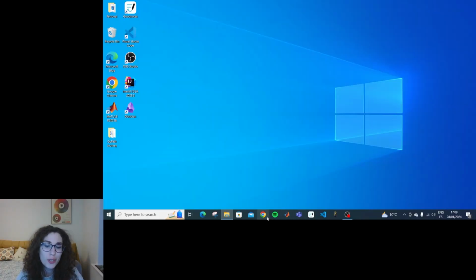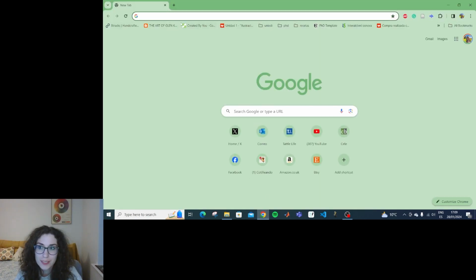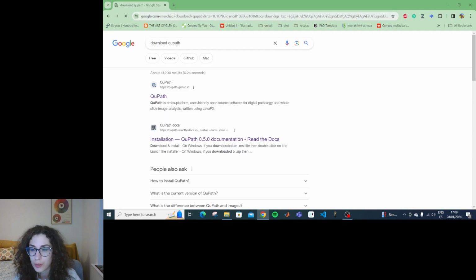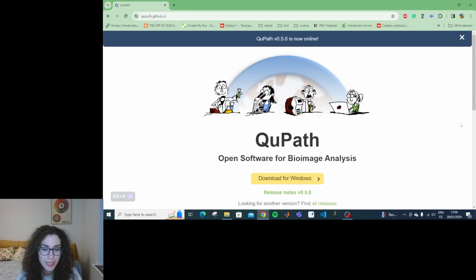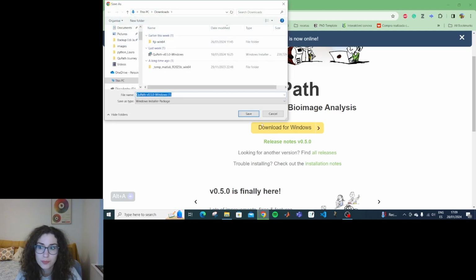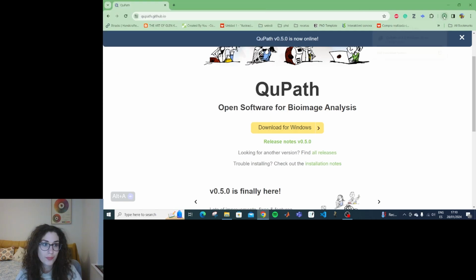Hi, let's install QuPath. For that, just use your favorite web browser, download QuPath, get this landing page, and you can just click here or use the arrow to select other installation options. Okay, let's open this up.